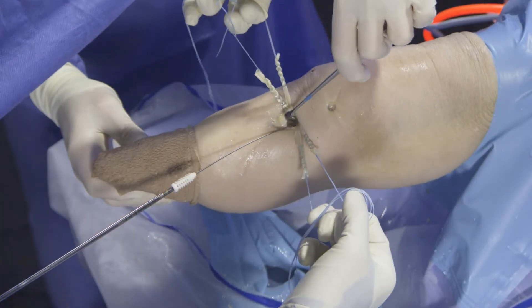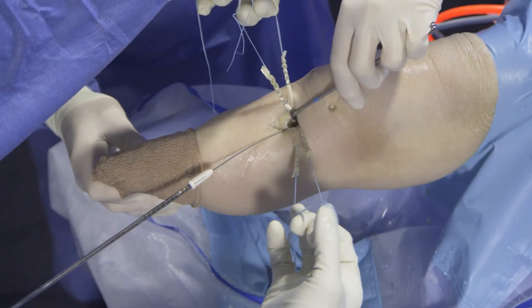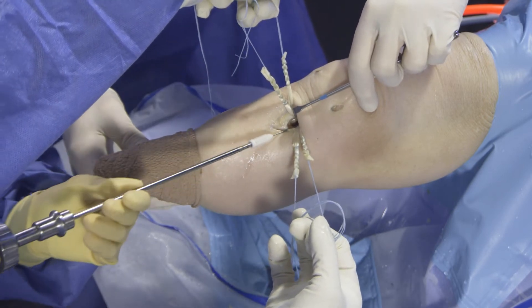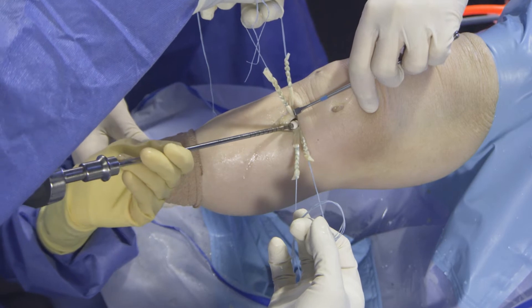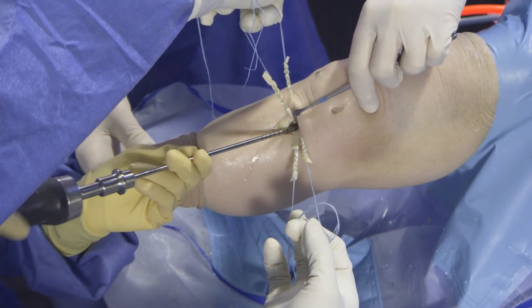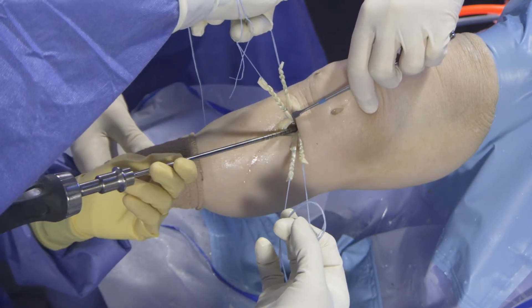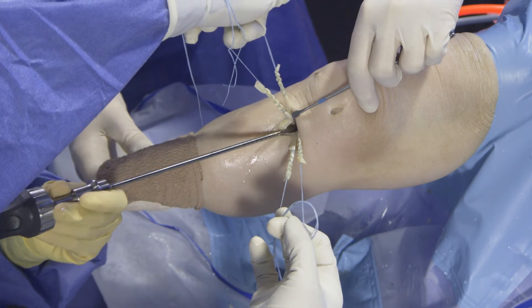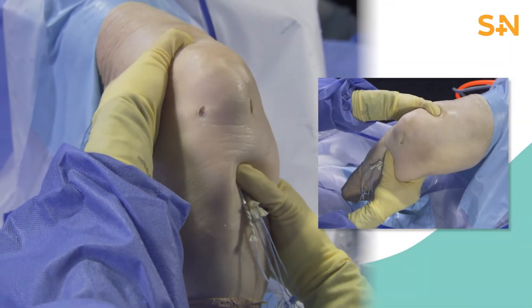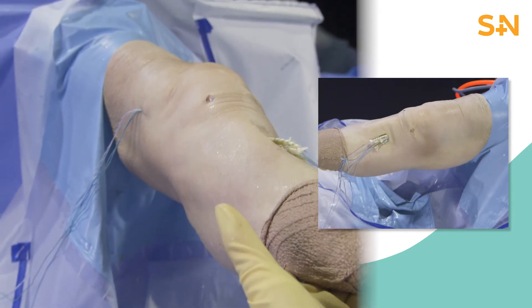To avoid any risk of capturing the knee, the knee is held in full extension as the distal ends of the graft are placed under tension and fixated with the BioSure Regenosorb screw. Currently, there is no clear consensus in the literature with respect to the best fixation angle for soft tissue ACL reconstruction; however, there are studies currently ongoing. Final examination of the knee reveals a negative Lachman and full knee range of motion.